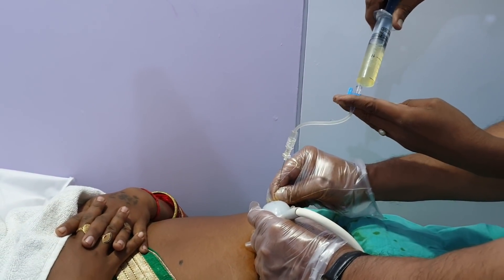This is the liquid I have taken. She has taken it.